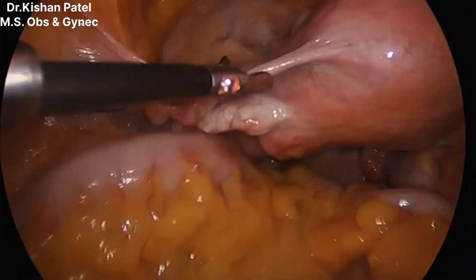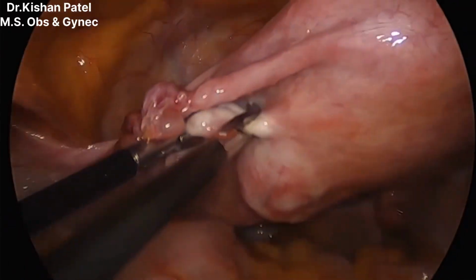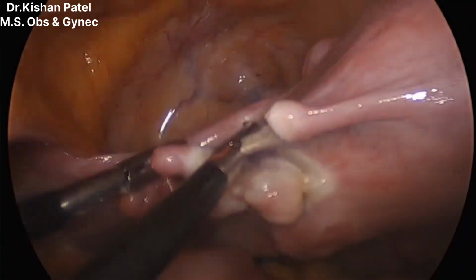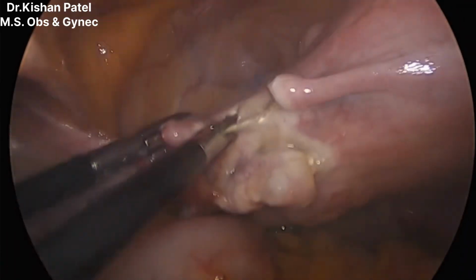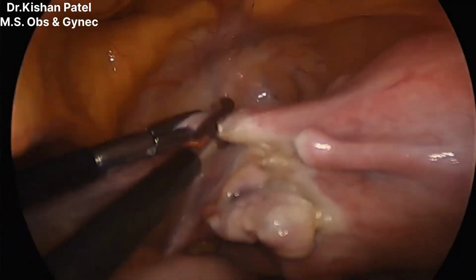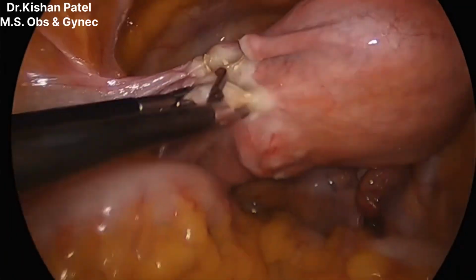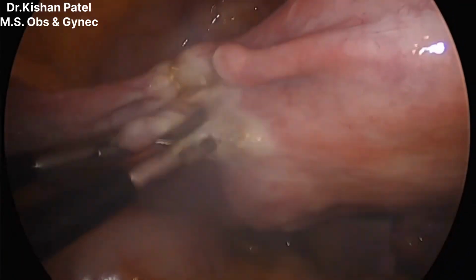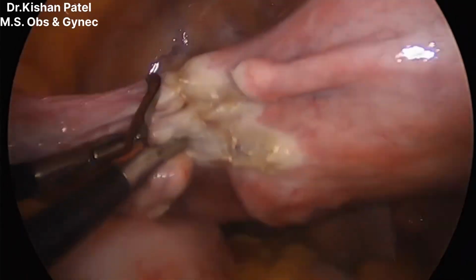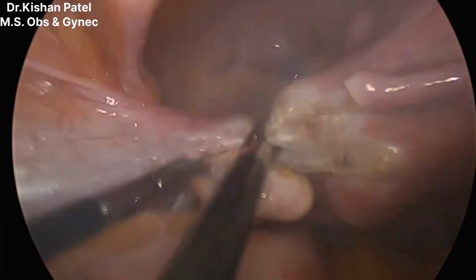and here we can see the ovarian ligament is merged in the fibroid and densely adherent. So we will separate the tube first, okay, then we'll put in the POD. Now we are coagulating the round ligament, ovarian ligament, separating from the uterus. Now this is the round ligament, we are coagulating and cutting.